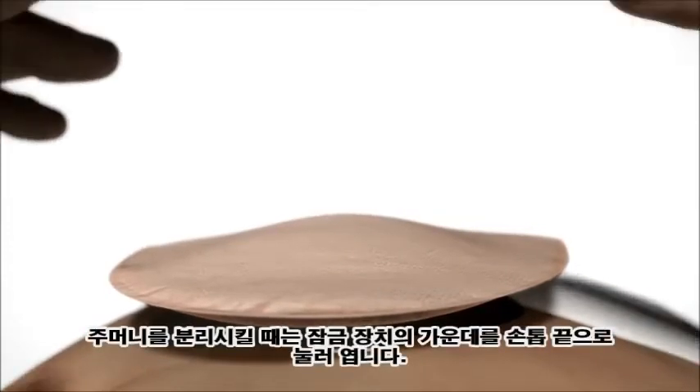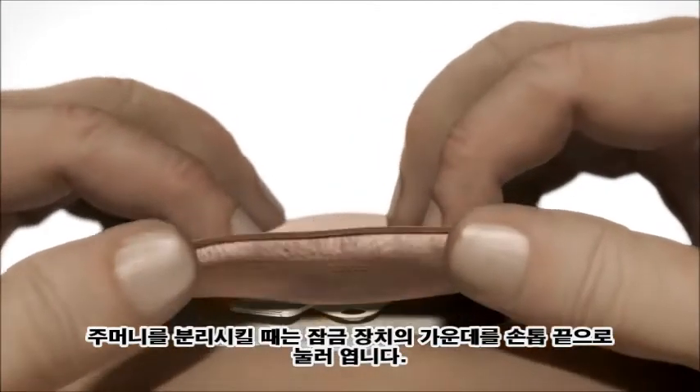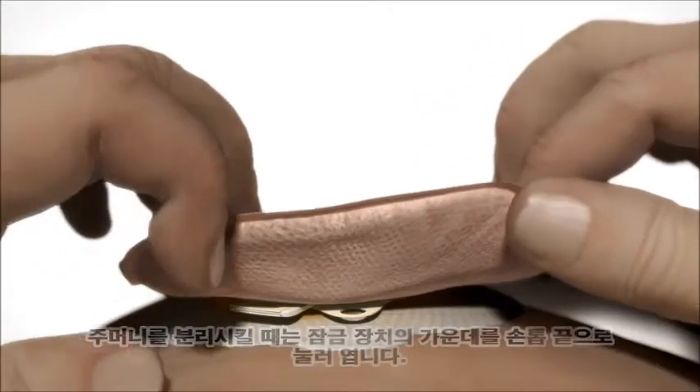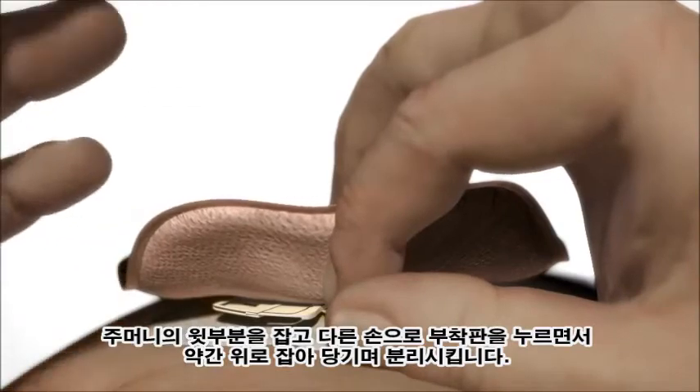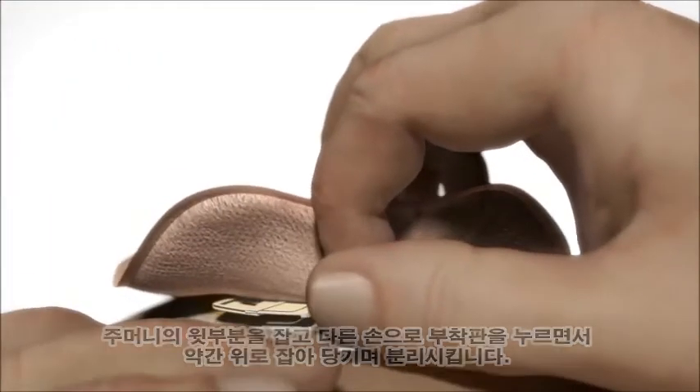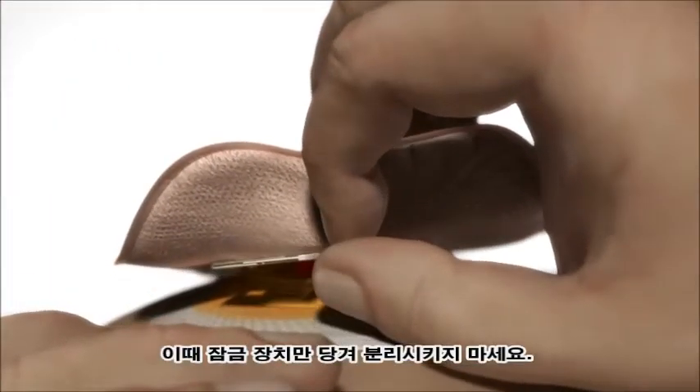To remove the bag, open the lock ring by pressing the small tab with a fingertip. Hold on to the top of the bag and pull slightly upwards and outwards to remove the bag from the base plate. Do not pull on the lock itself.